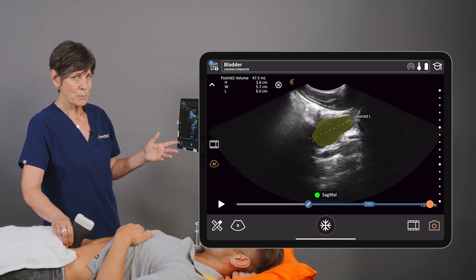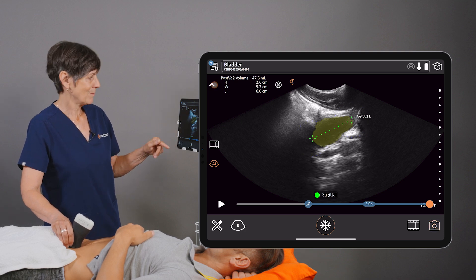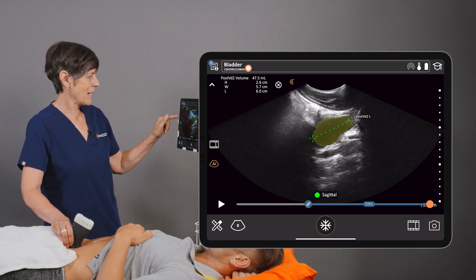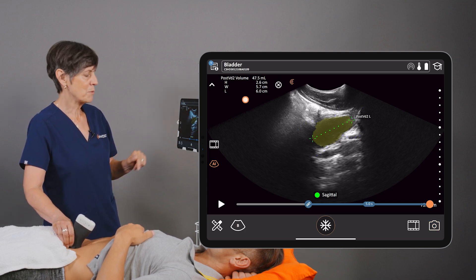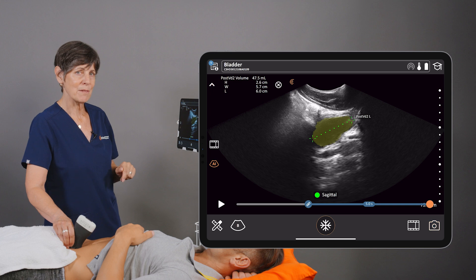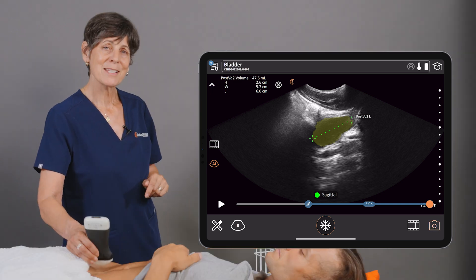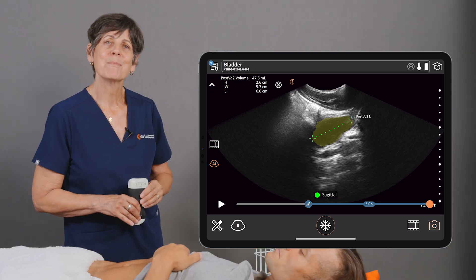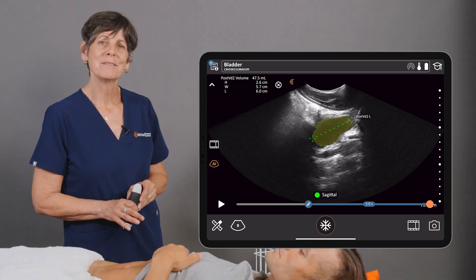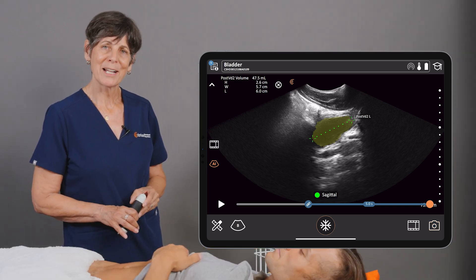Our calipers are bang on and we're getting a nice post-void residual volume of 48 mils. That's how you perform a post-void volume with bladder AI.